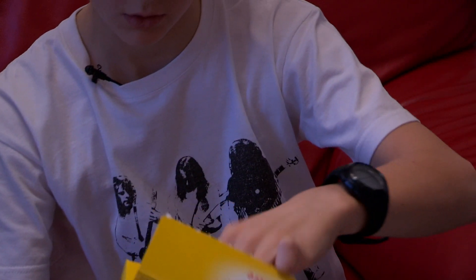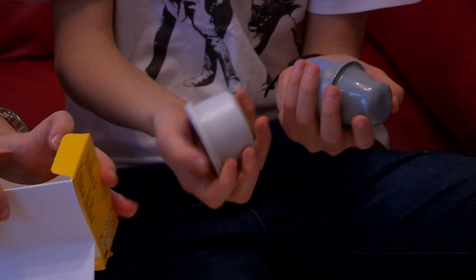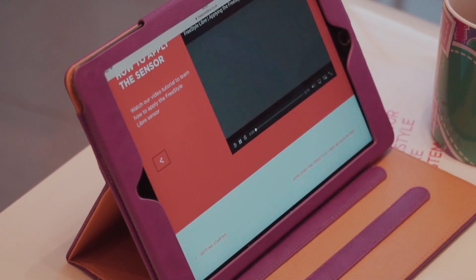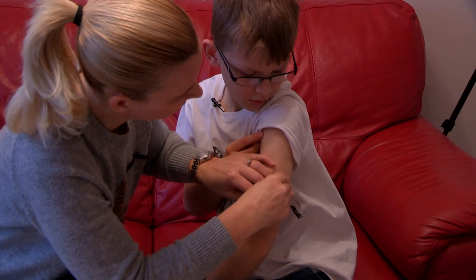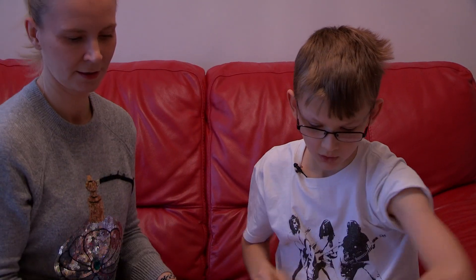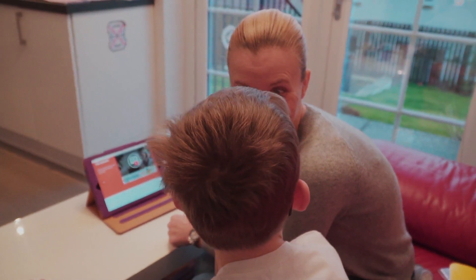The sensor comes in two parts. The video says to clean the spot where you want your sensor with the alcohol wipe. We're going to go for the back of the arm. Leave it to dry in the air. So I've just watched the video and now I'm going to actually put the sensor on.